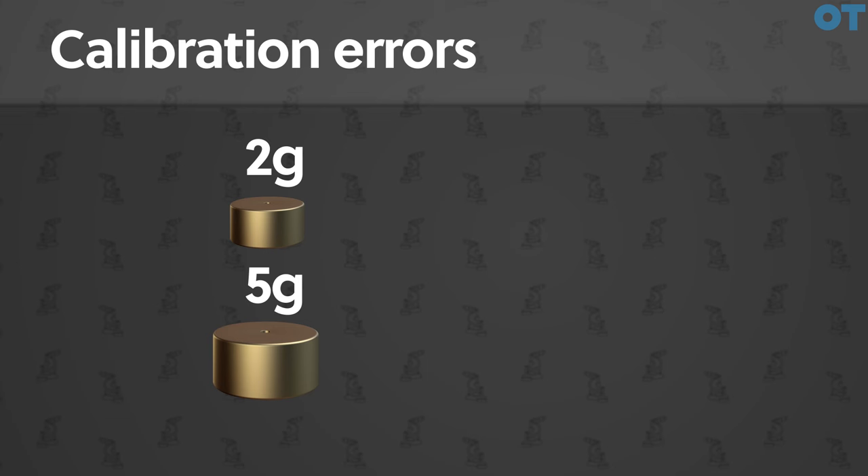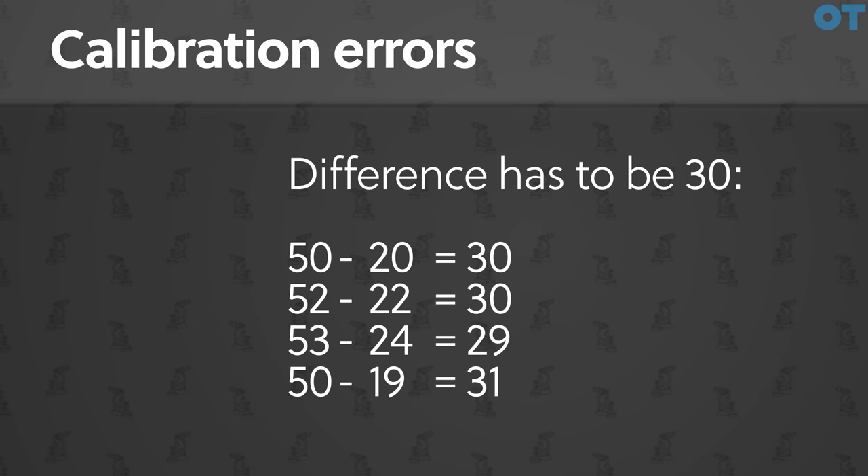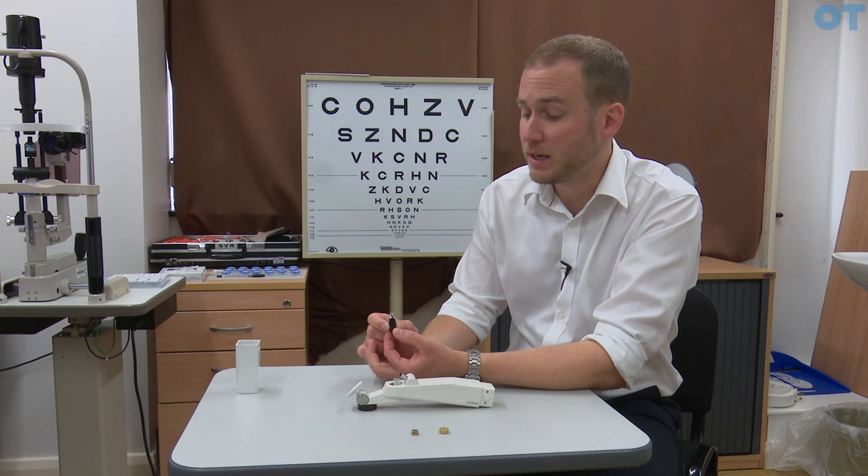If we find that we don't get the readings we are expecting, there are situations where we can still use the instrument. For example, if we find for the two gram weight the pressure is 22 and for the five gram weight 52, because the difference is equal we can still use that but we have to compensate when we record the intraocular pressure — we would take two off both of those measurements. The recorded pressure between the two weights should always be 30. If that is the case, taking into account any difference, we can still use the instrument.